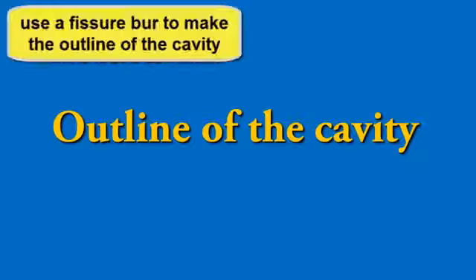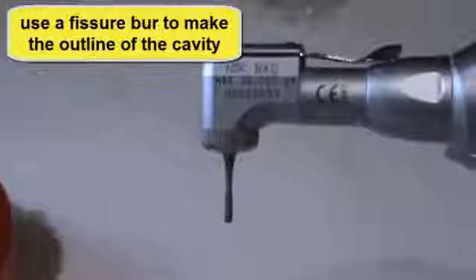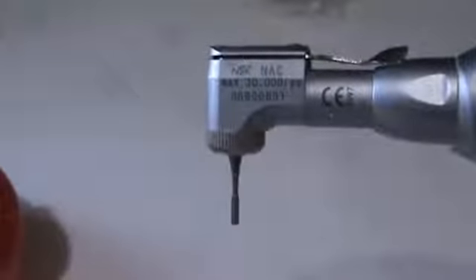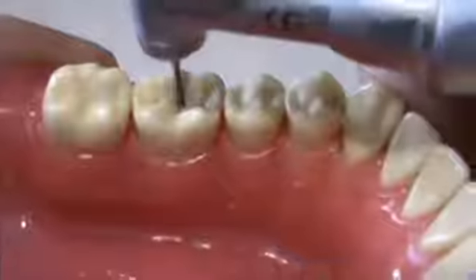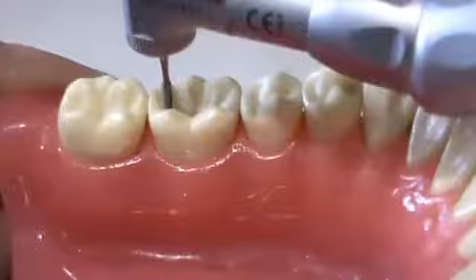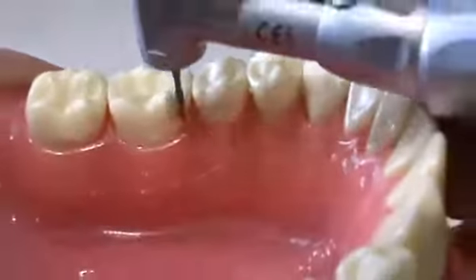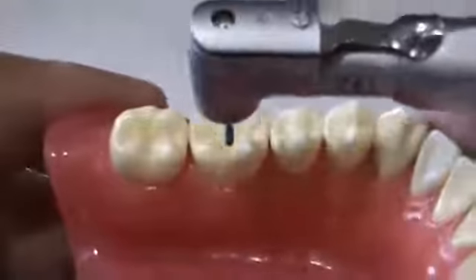Step 2. Outline of the cavity. By the use of a fissure burr, we make the outline of the cavity. The burr is held also perpendicular to the occlusal plane inside one of the holes, and then we move it along the fissure to the other hole.